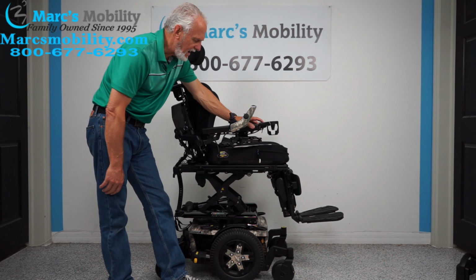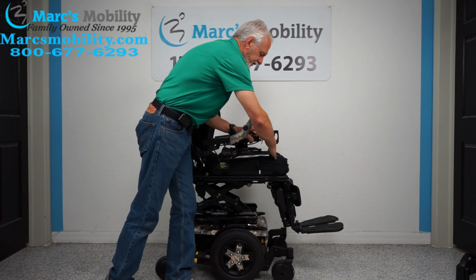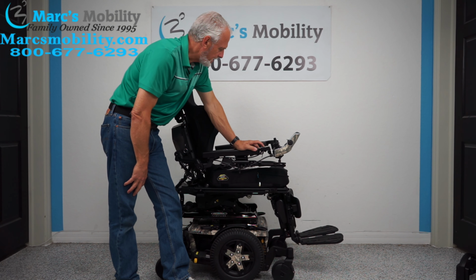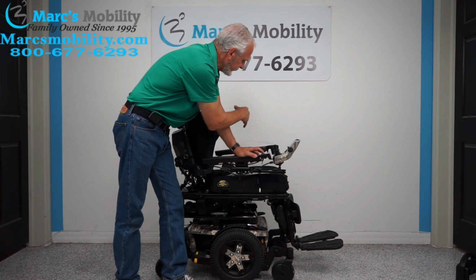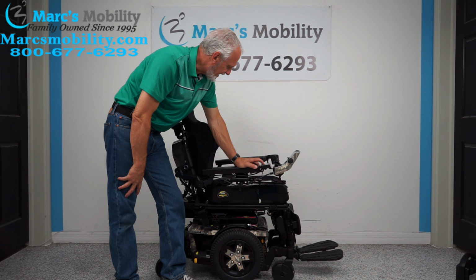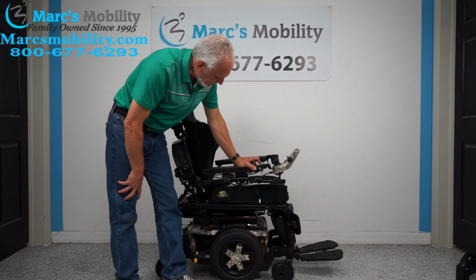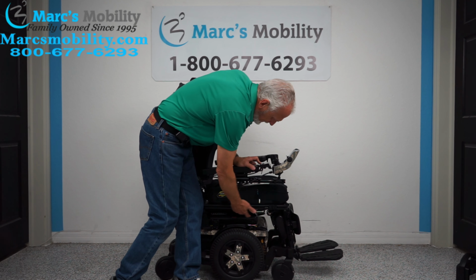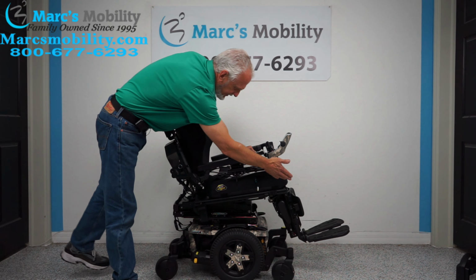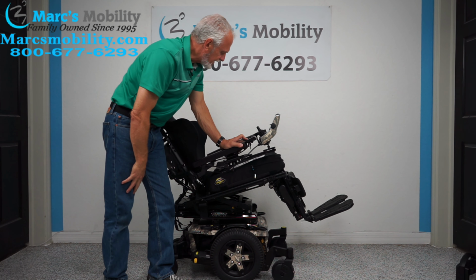So if you want to get to a dining table and you don't want to have to raise the arm because you want the dining table to get real close to you, you just swing the joystick this way. If you're left-handed, we can switch all this to the left side, okay? So we're almost all the way down. The next feature I'm going to show you is called the electric tilt. The electric tilt is when the base right here starts going back. So when this base goes back, of course it's going to take the legs, it's going to take the back because they're all connected together. This is called the electric tilt.